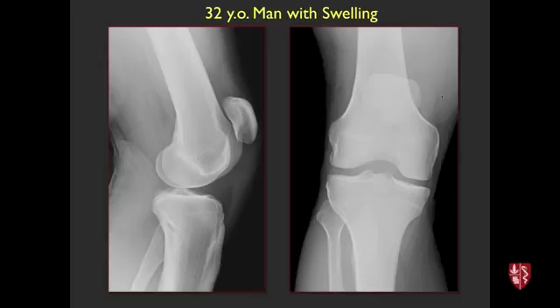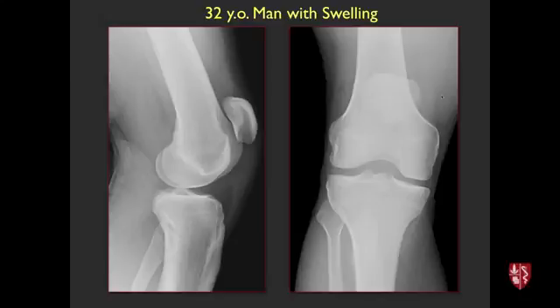This multifocal enthesitis pattern could also be seen with reactive arthritis such as what used to be called Reiter syndrome. So the differential should be broadened to seronegative spondyloarthropathies in general.